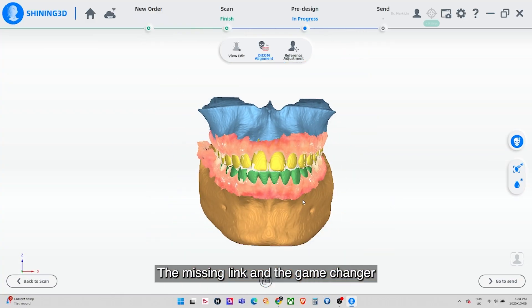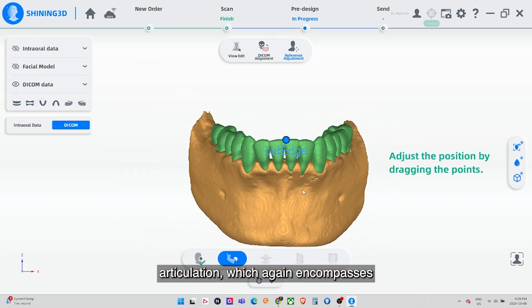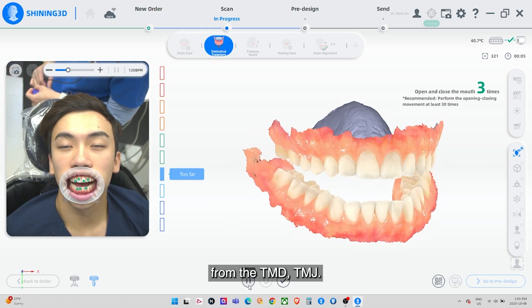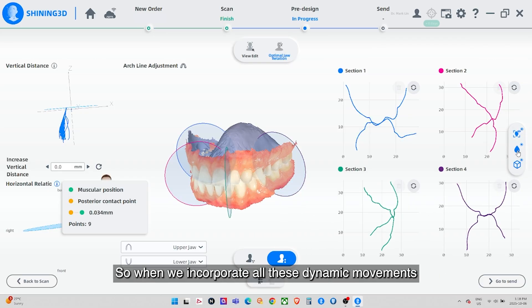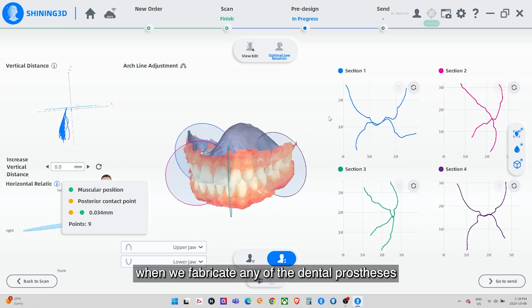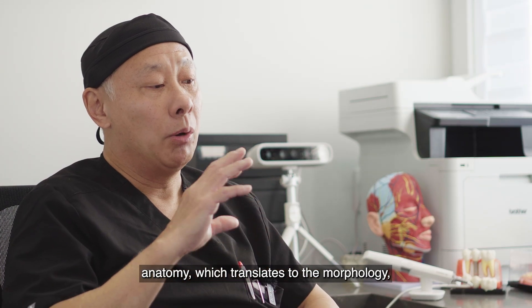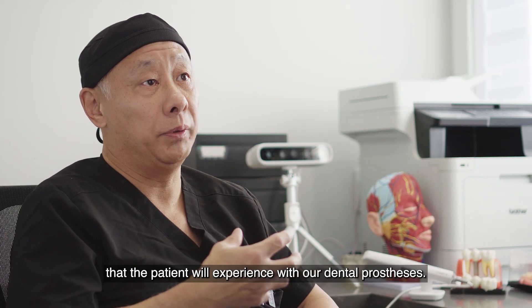The missing link and the game changer here is that we have a virtual articulation which encompasses the neurosensory feedback from the patient's muscles and the TMJ. Every patient's anatomy is slightly different. So when we incorporate all these dynamic movements, these are the real game changers — when we fabricate any dental prosthesis, we minimize adjustments and replicate what's in the patient's anatomy, which translates to the morphology, anatomy, and the form and function that the patient will experience with our dental prosthesis.